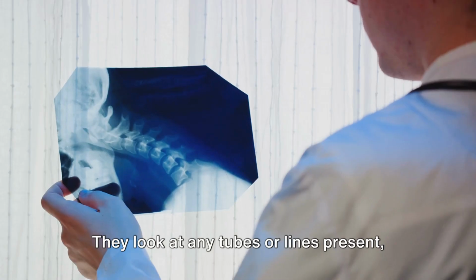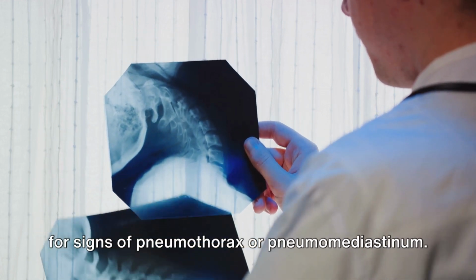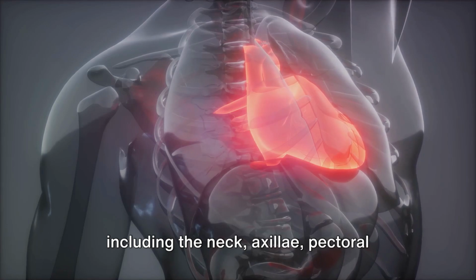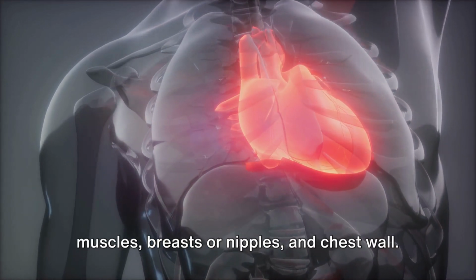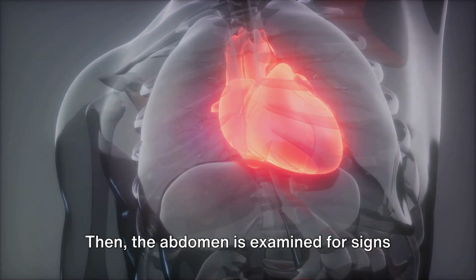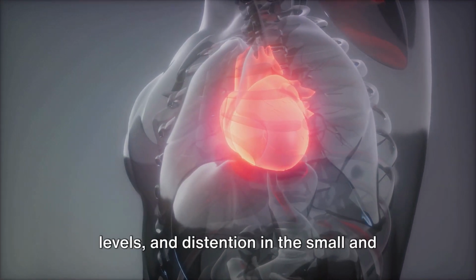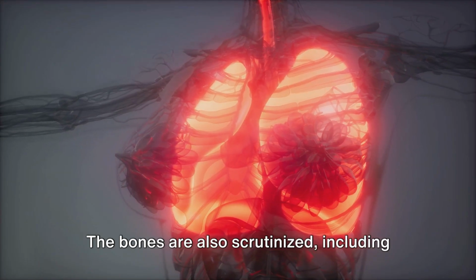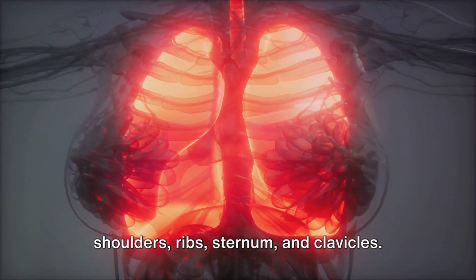They look at any tubes or lines present, checking their position and being alert for signs of pneumothorax or pneumomediastinum. The soft tissues are inspected next, including the neck, axillae, pectoral muscles, breasts or nipples, and chest wall. Then the abdomen is examined for signs of free air under the diaphragm, air fluid levels, and distension in the small and large bowels. The bones are also scrutinized, including the cervical and thoracic spine, shoulders, ribs, sternum, and clavicles.